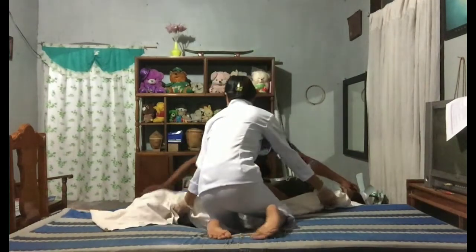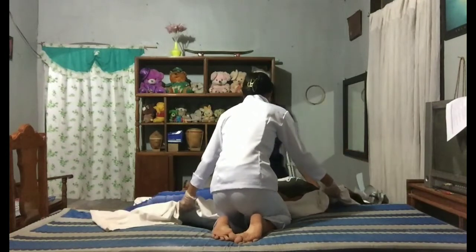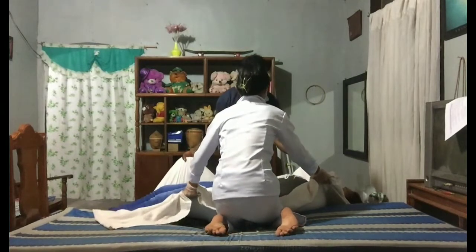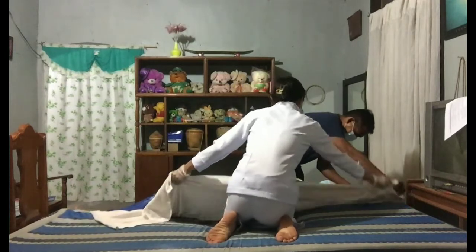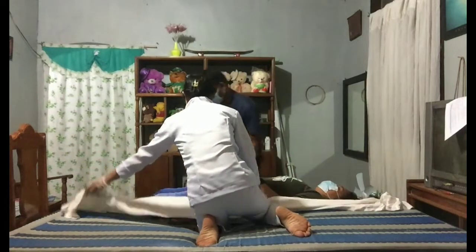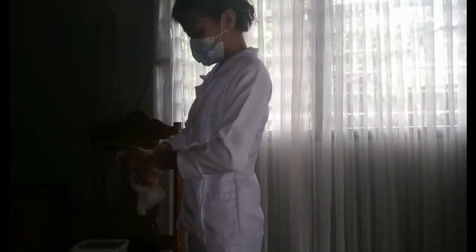On the count of three, the nurse standing on the stretcher side of the bed pulls the sheet while the nurse kneeling on the bed lifts the draw sheet, transferring the client's weight toward the transfer board and pushing the client from the bed to the stretcher. Remove the transfer board if used. Raise the side rails of the stretcher, transfer any IVs to the IV pole of the stretcher, and place the client comfortably on the stretcher and drape properly. Remove gloves and perform hand washing.